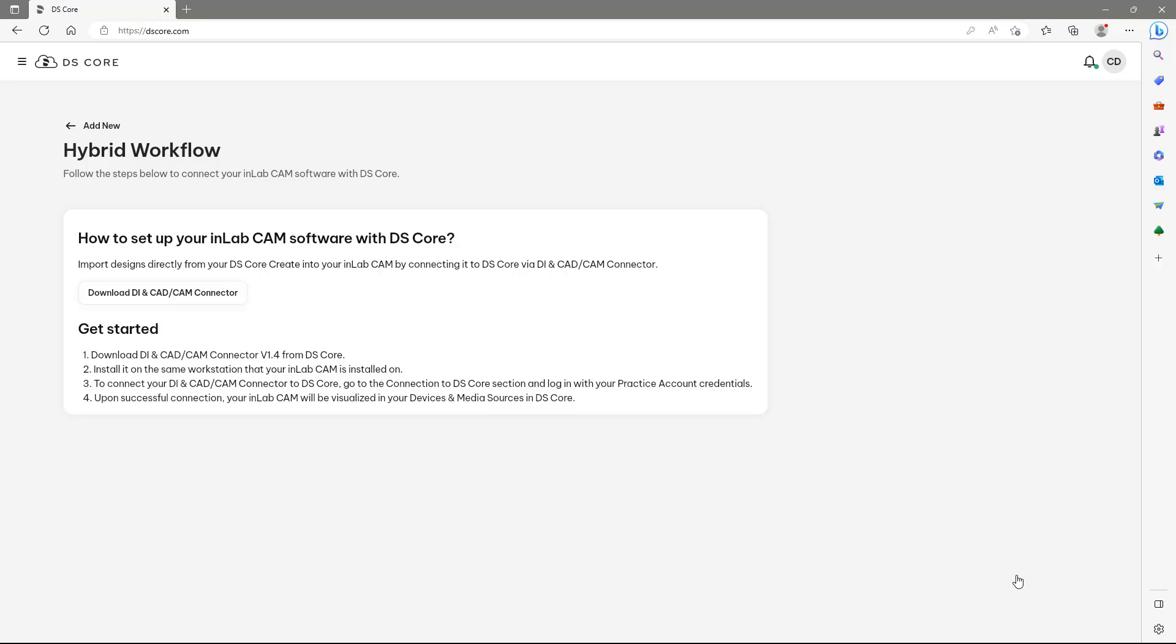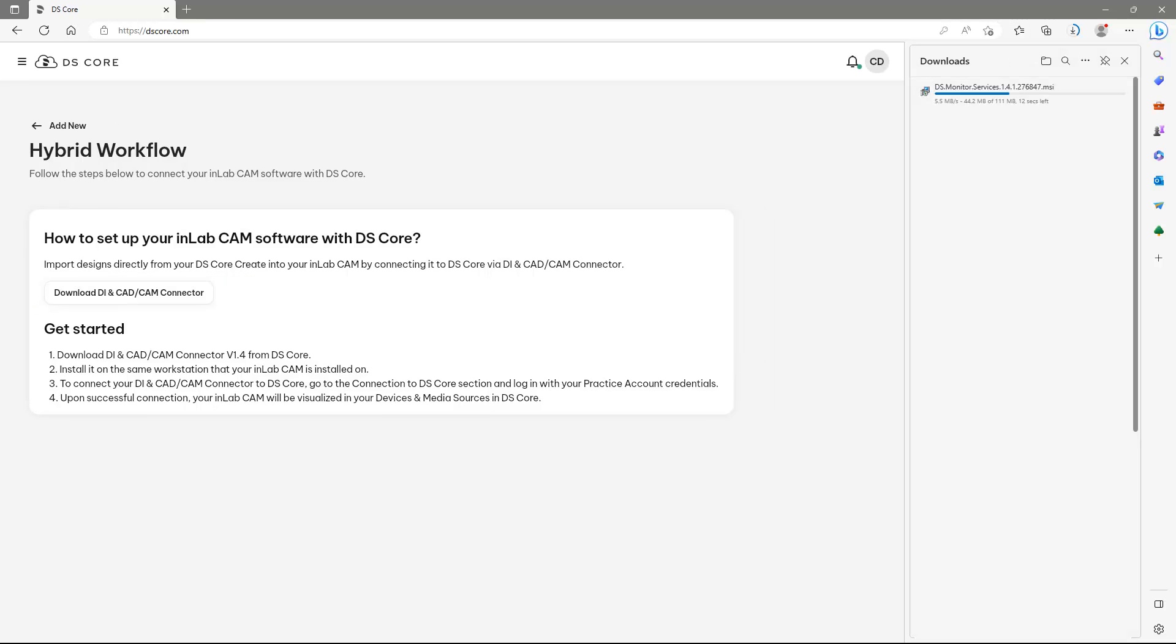Here we download the DI and CAD-CAM connector. The download status is shown on the top right. This can be different depending on your web browser.